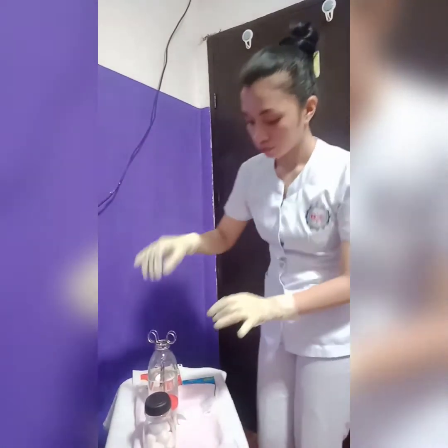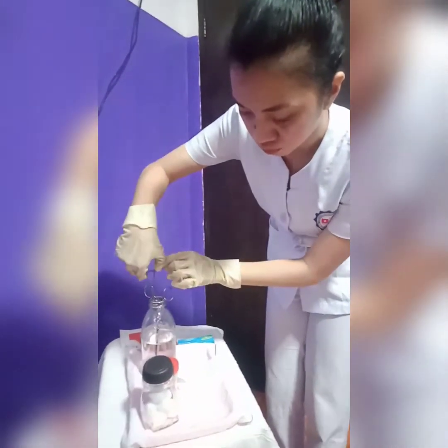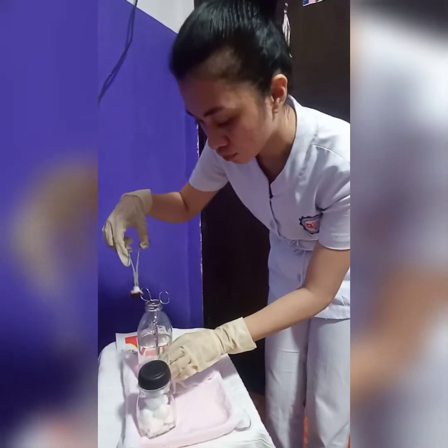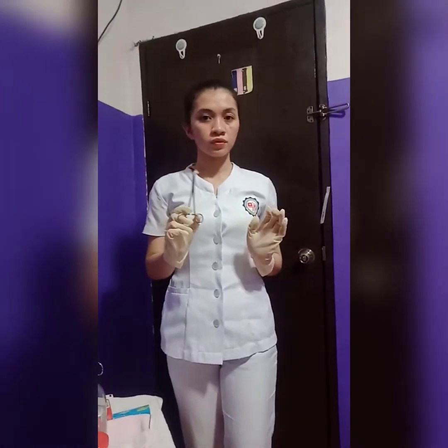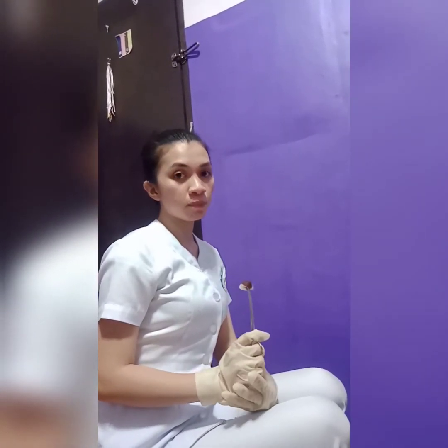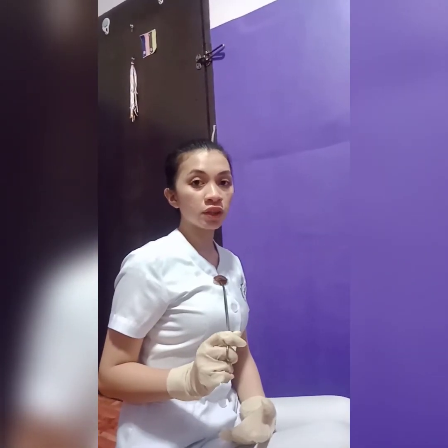Next is to clean the wounds using cotton balls with antiseptic solution with dressing forceps. Clean the wound going outward motion for aseptic wounds, using aseptic wound dressing forceps. Ensure proper technique to avoid contamination of the wound or any infection.